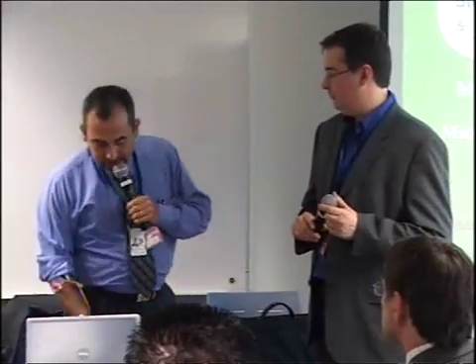What is the autonomy of the system with batteries? The electronics, 11.8 hours for continuous use. This means that the patient is doing this all the time. And this is not real use. We grasp an object, we put it back inactive, we walk about, no hand movement. Perhaps 20% of use. And this might be 4 or 5 or even 6 days without recharging the battery. This will depend on the use to which the prosthesis is put, on the patient.